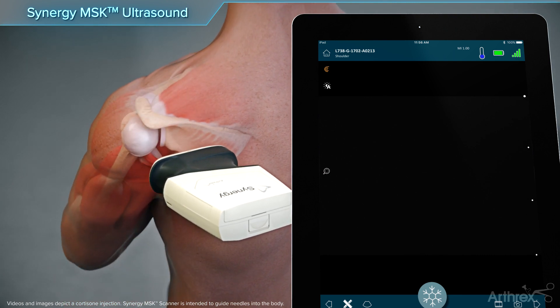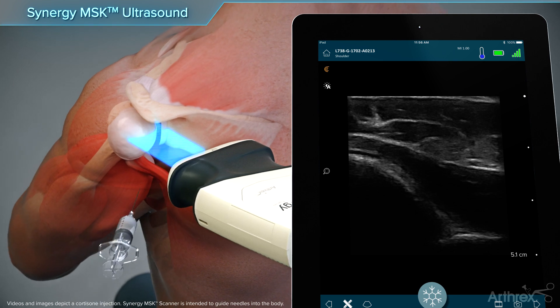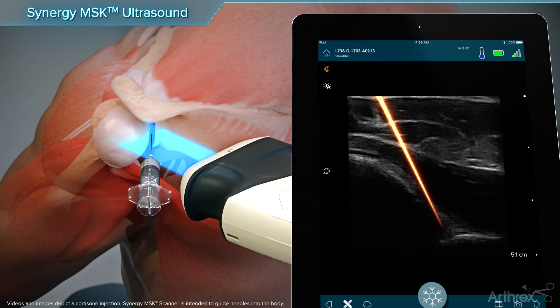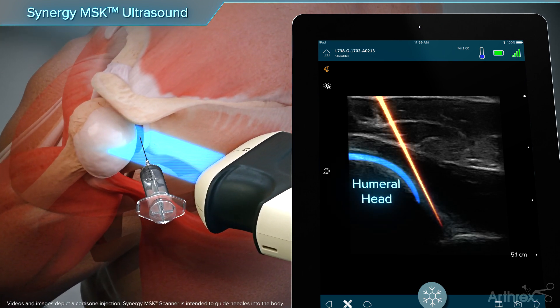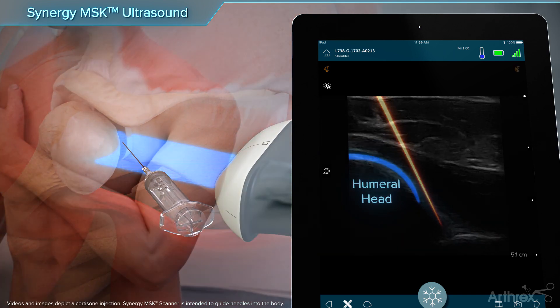To visualize the glenohumeral joint, the arm is positioned with the ipsilateral hand placed on the contralateral shoulder. The scanner is placed just caudal to the acromion over the infraspinatus tendon. In plane with the scanner, the needle is positioned between the free edge of the labrum and the cartilage of the humeral head.